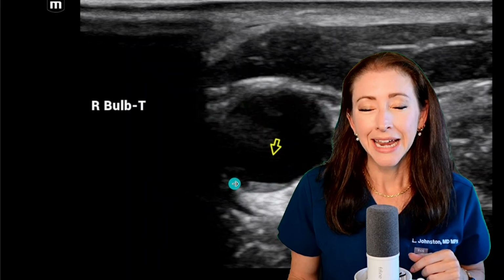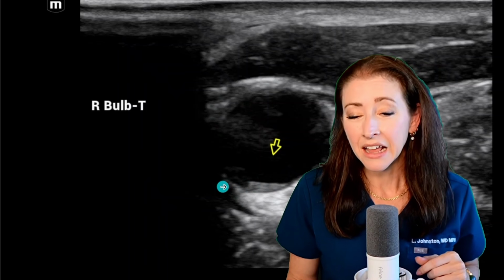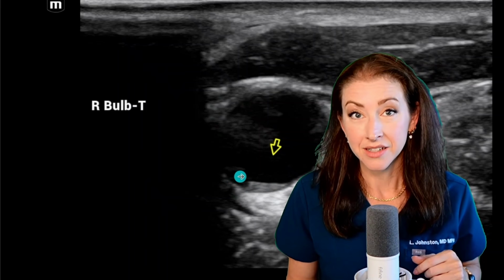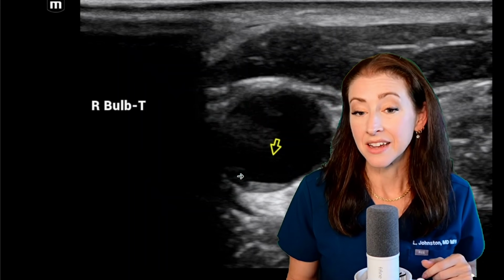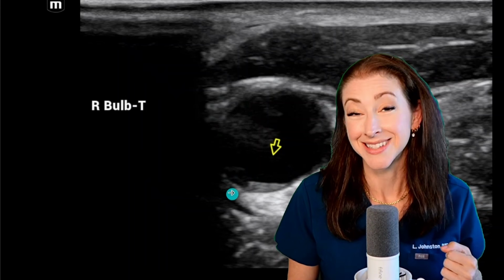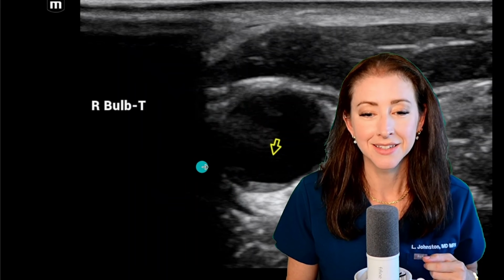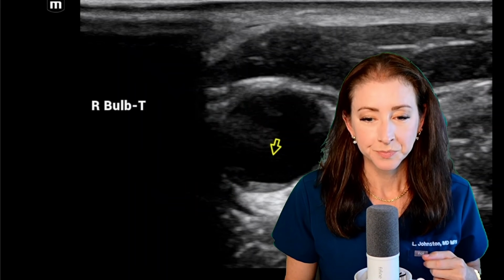It doesn't look terribly soft, right? It's not echolucent, it's not black, but it's also not calcified. So this is a heterogeneous thickening, or if it were thicker, it would be called a plaque. It's not, but it's sort of medium, I would say, in its characterization.